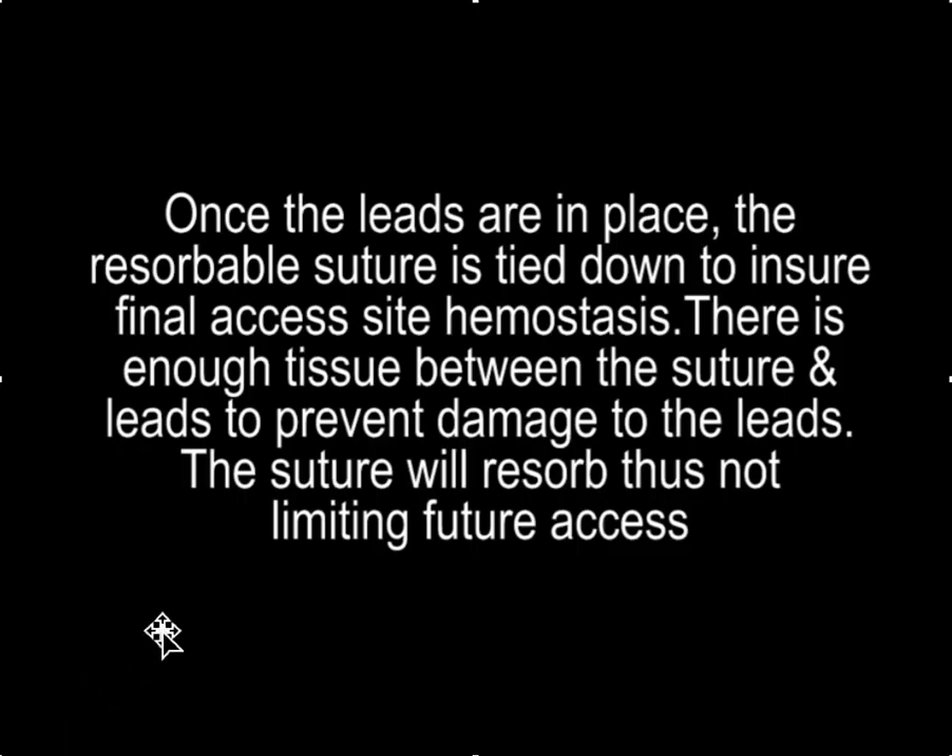Once the leads are in place, the resorbable suture is tied down to ensure final hemostasis. There is enough tissue between the suture and the leads to prevent damage to the leads, and because the suture will absorb, it won't limit access in the future.